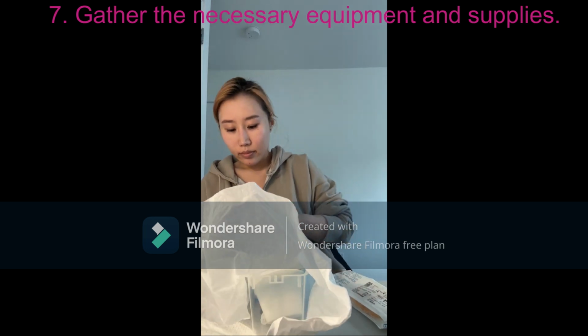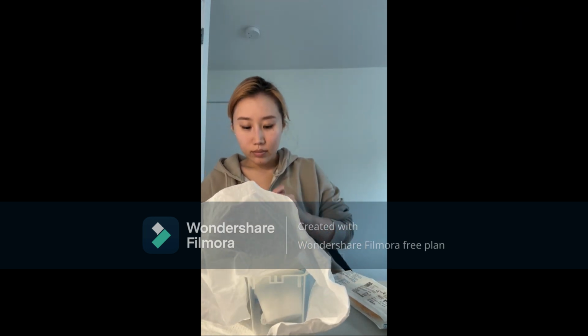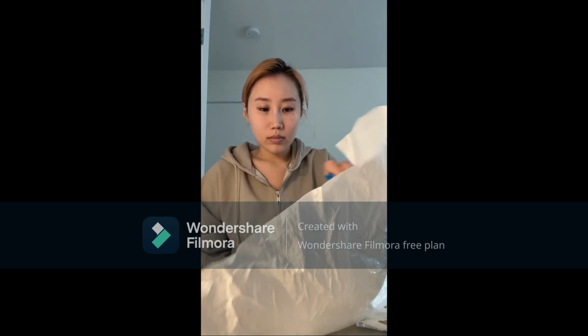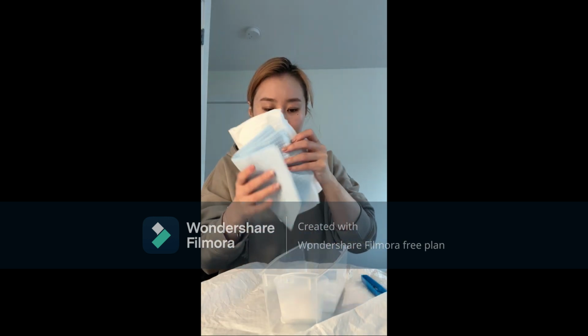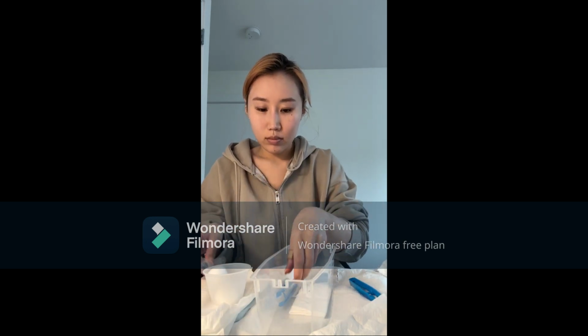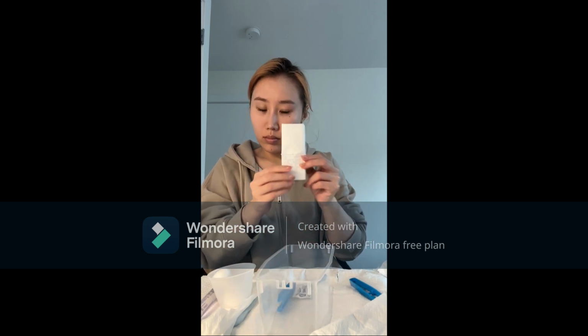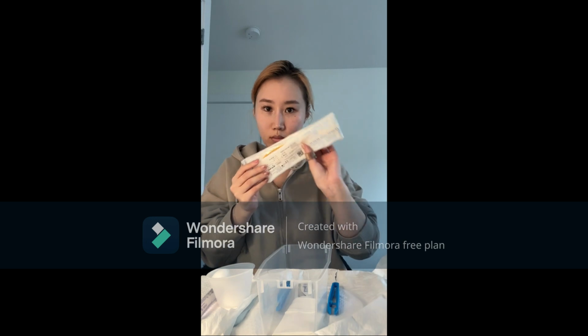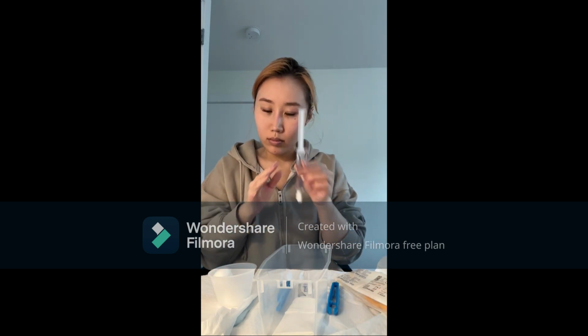This includes an indwelling catheterization tray. This tray carries your cleansing medium, either pre-moistened swab sticks or sterile cotton balls, sterile forceps and antiseptic solution, a water-soluble lubricant, the catheter, and a pre-filled syringe, with which you will inflate the balloon.